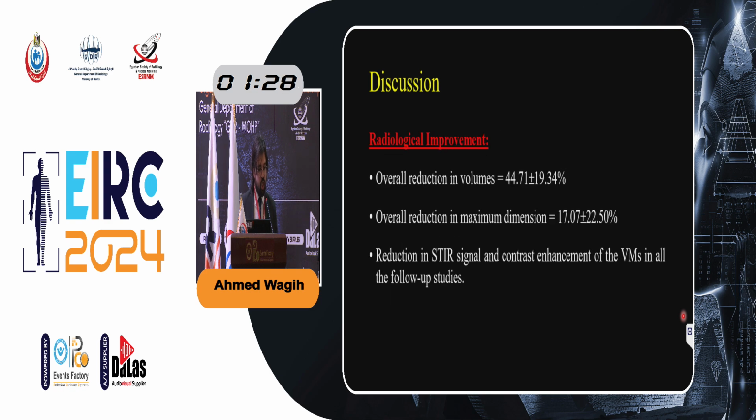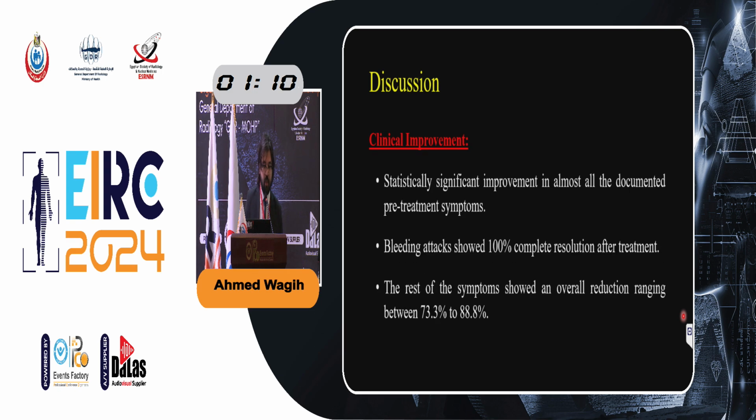When it comes to radiological improvement, there was an overall reduction in volumes, about 44%, and an overall reduction in maximum dimensions of the lesions, about 17%, as well as reduction in STIR signal and T2 signal and contrast enhancement in all of the cases during the follow-up studies.